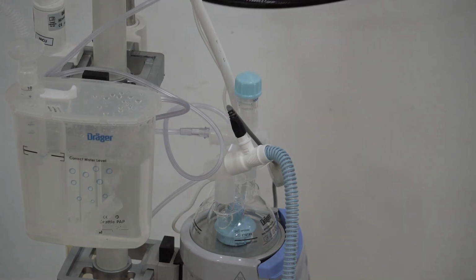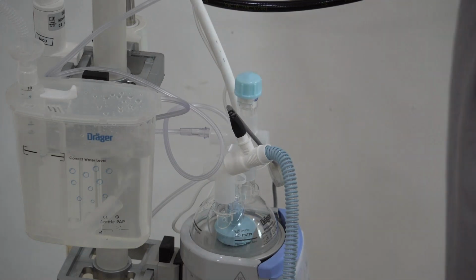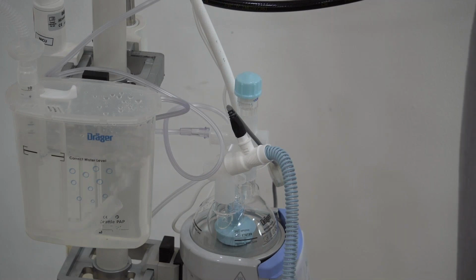And they compared the volumes that are being delivered, because obviously here we have no way to control the tidal volume, because we don't have a flow sensor at any point.